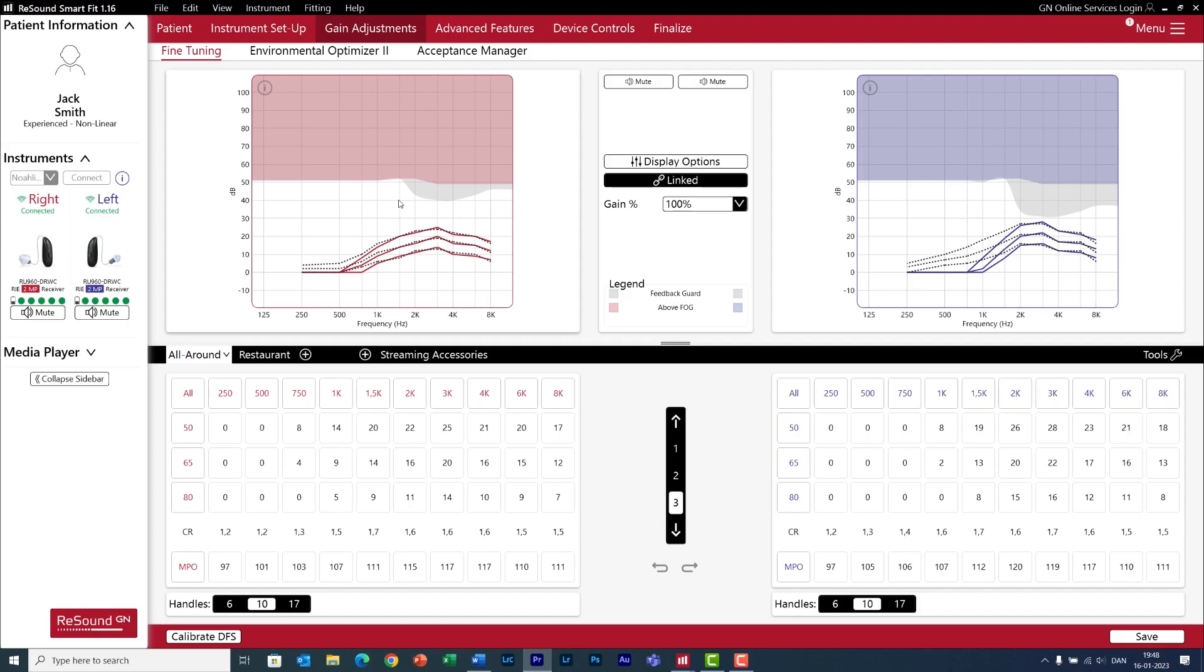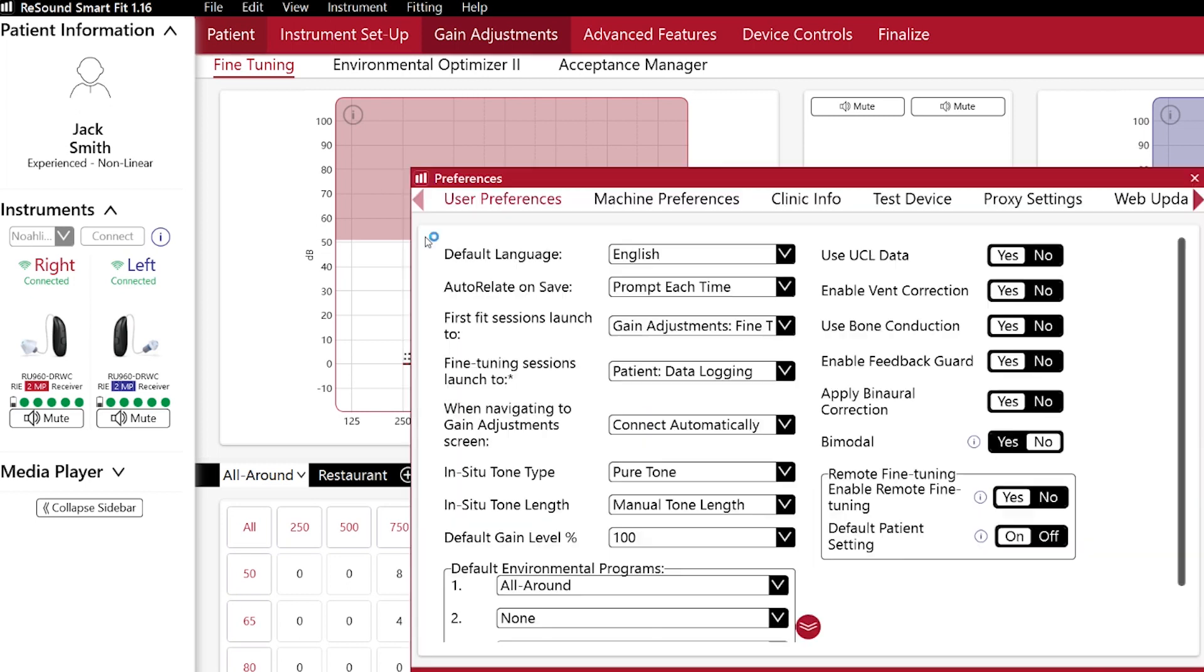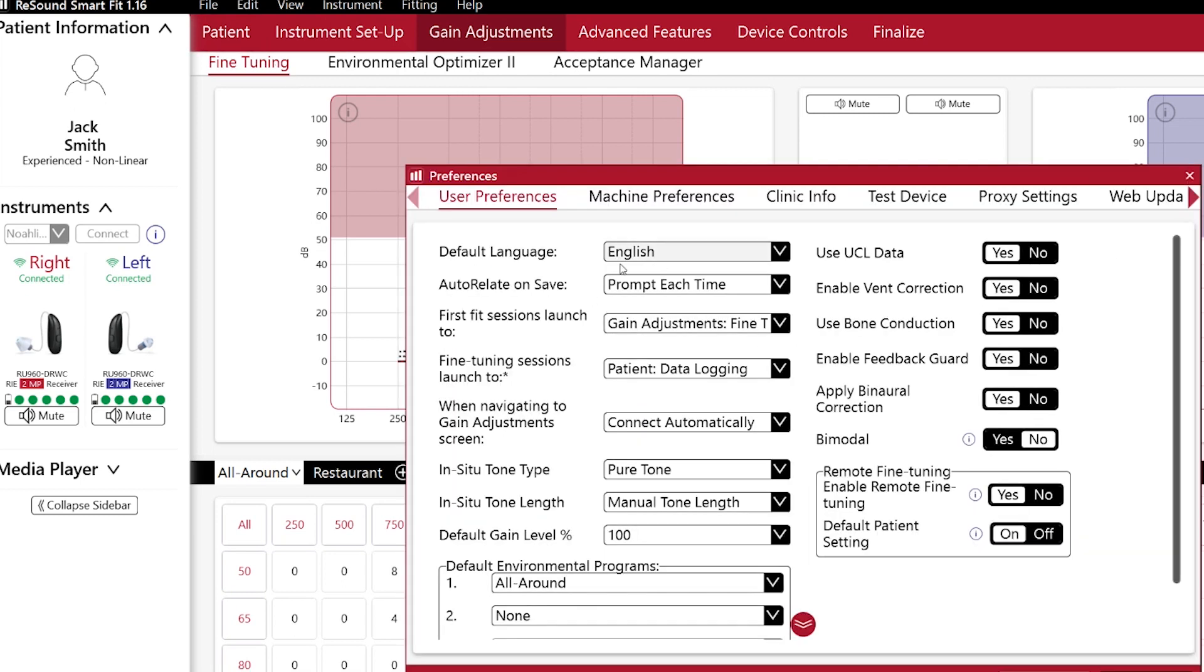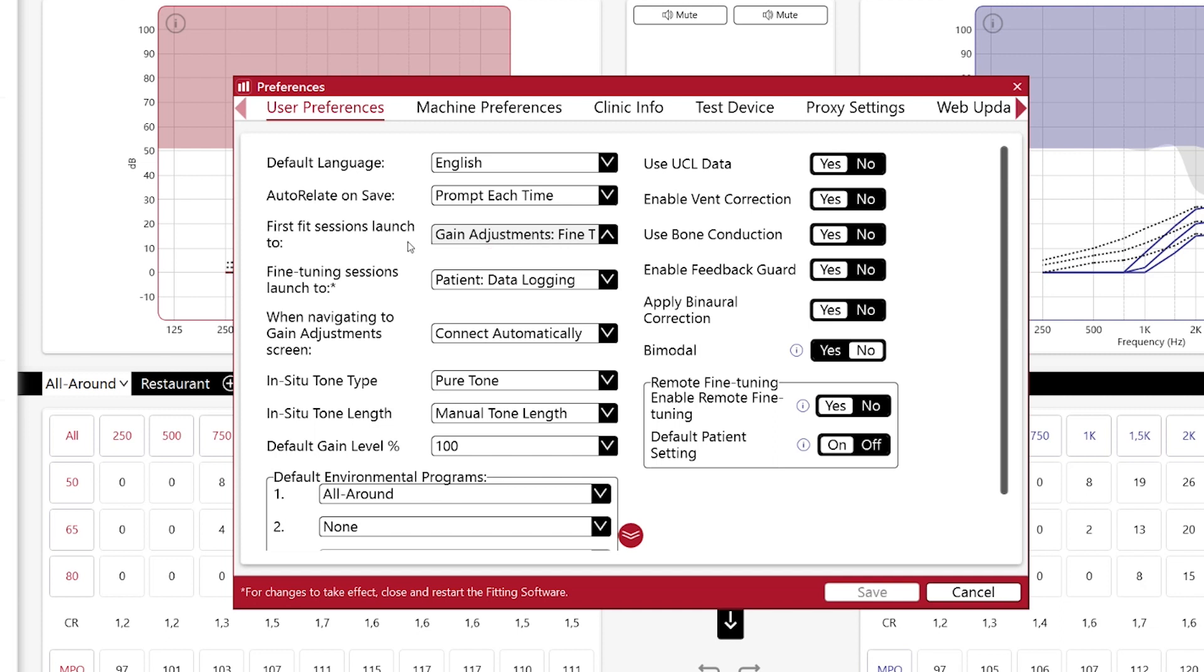You can save a lot of time in your daily fittings by configuring your preferences in SmartFit. Go to Edit, Preferences, and have a look at the different options. For example, I've told the software that for every first session, I want to go directly to gain adjustments so I can do fine tunings. And for every follow-up session, I want the software to show me data logging when I start my session.